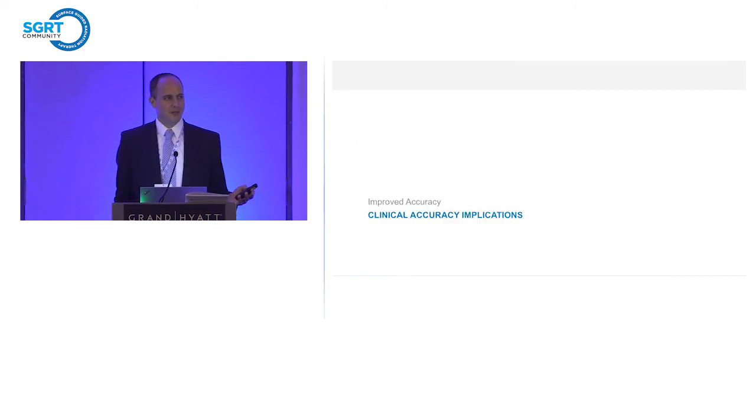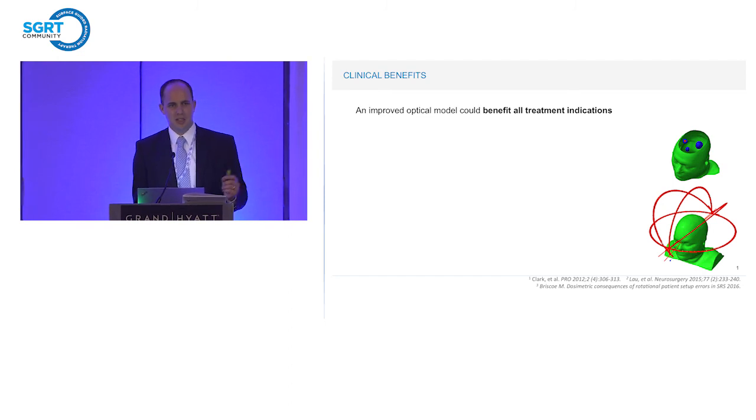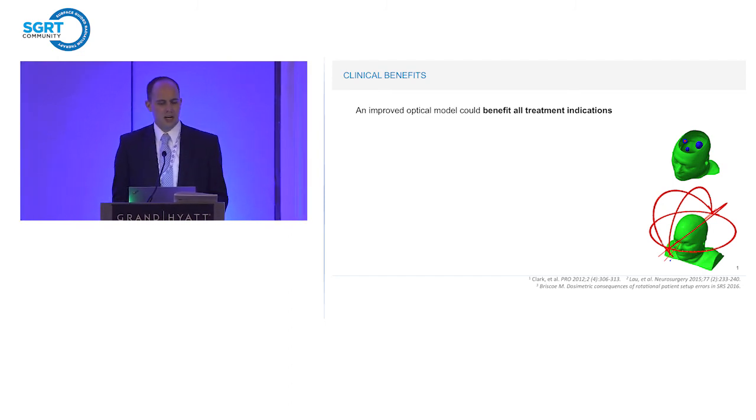So what does this mean for all of us? Well, first of all, I believe that this could benefit all treatments. We've looked at sub-millimeter accuracy, and one question could be, well, I'm just treating breast, why do I care about 0.2 millimeter accuracy? An additional benefit, which I haven't really shown the data here, but is just the stability.